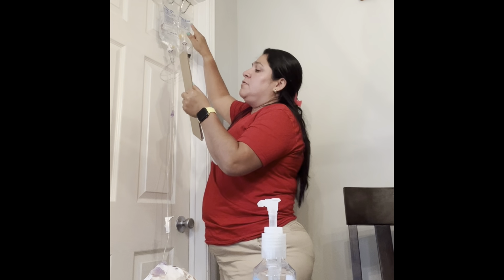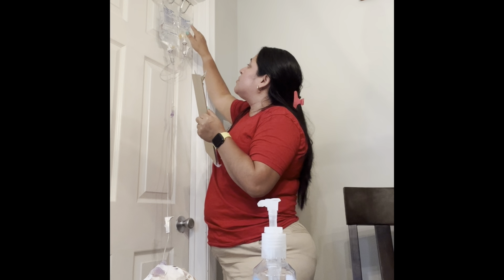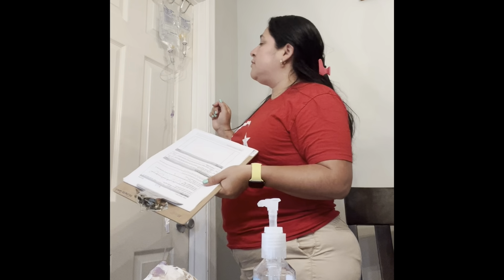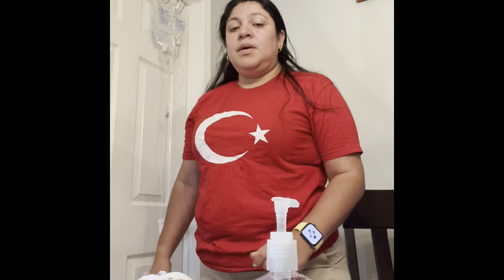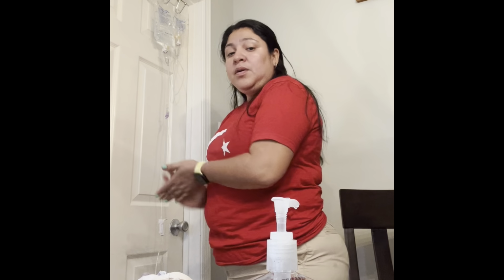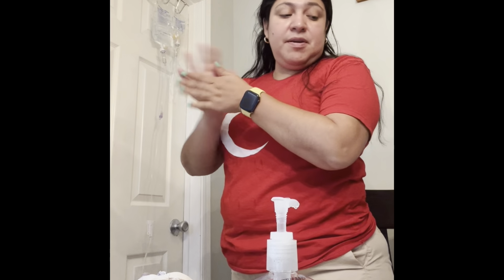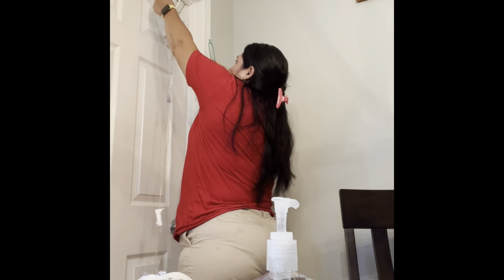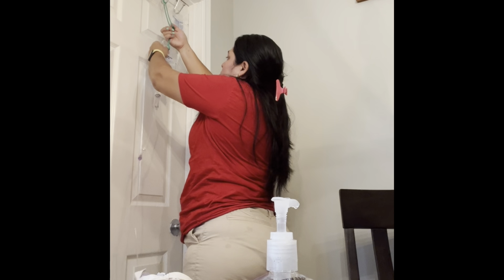So I have cefazolin sodium 1 gram, and sodium chloride 50 ml. Medication is not expired until April 2025. I have the correct patient, Rene Adams, May 25th, 1978. After I do that, I am going to clean up my hands, clamp completely my primary line. After I clamp my primary line, I am going to bring my sodium chloride bag lower than my IV antibiotic, because this is gonna work with gravity.